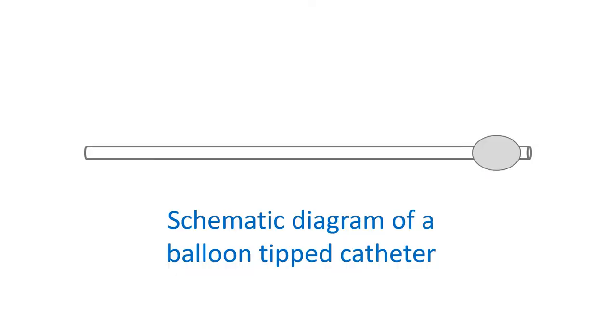Sometimes echocardiography, ultrasound imaging of the heart, may also be used to guide the catheter within the heart. Bedside cardiac catheterization can be done using special flow-directed catheters which have a balloon at the tip. When the balloon is inflated while in the right upper chamber of the heart, right atrium, the catheter takes the course of the blood flow into other chambers. This method is usually used to measure the blood pressure in the pulmonary artery, blood vessel of the lungs.